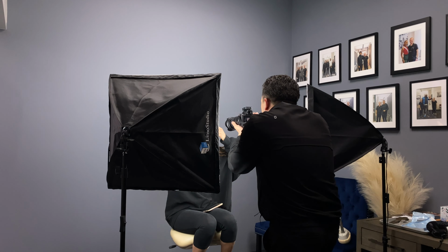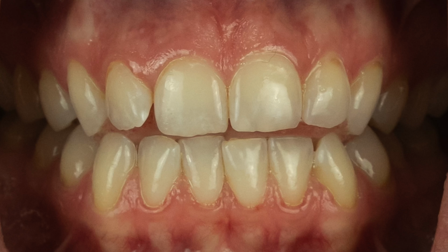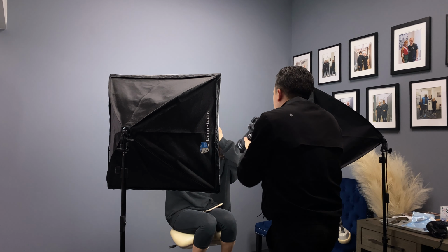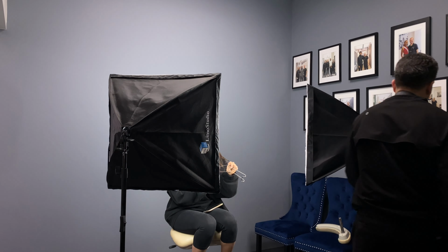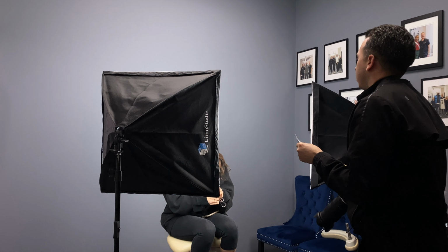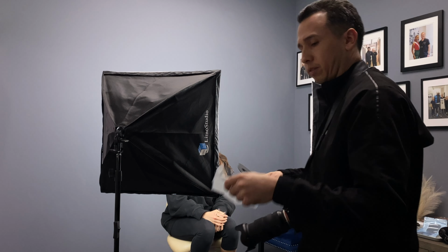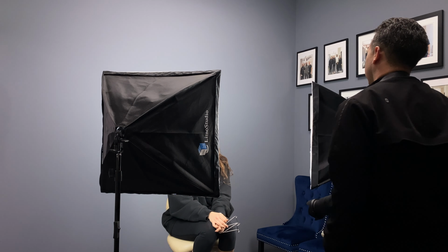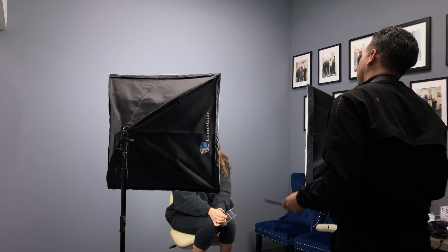I can get them all done in about 5 minutes, and you can see here that my camera movements don't really move a whole lot. I'm standing straight in the same spot. My feet are in the same position every single time I'm taking a photo. And the only time when I'm moving to the side, I'm reaching, and typically I don't move my left foot. It's always staying in the same spot, so that way I can get consistent photos every time.